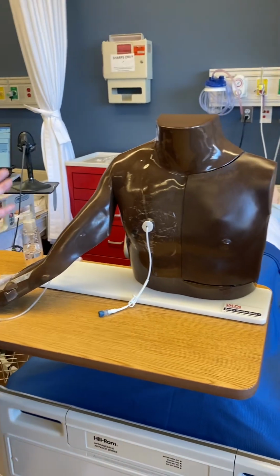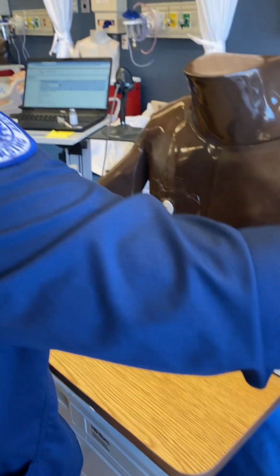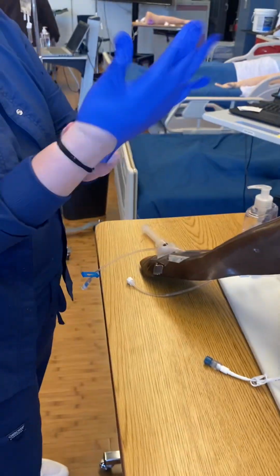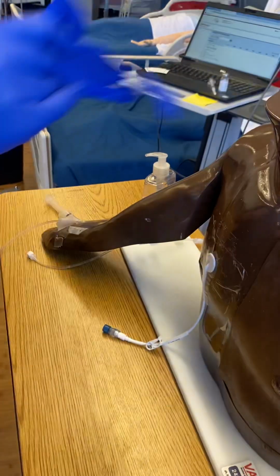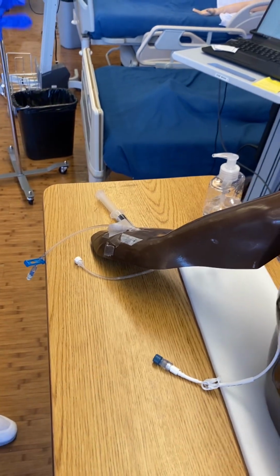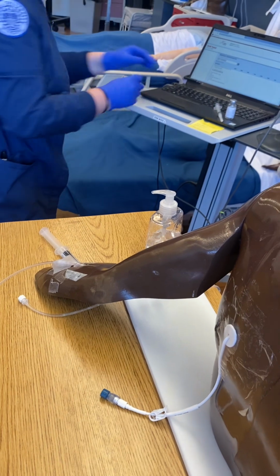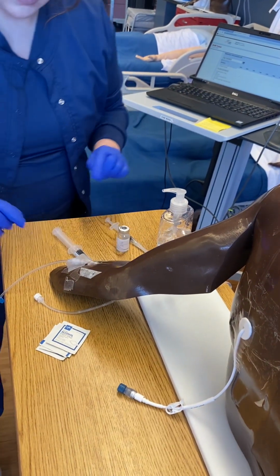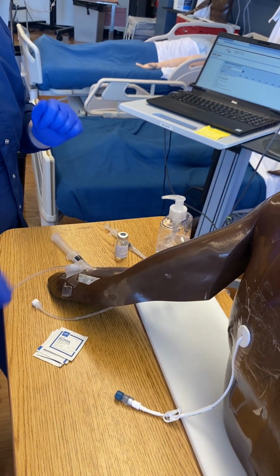So I'm gonna come down here. We're gonna pretend that that's Red's arm right here. So I'm gonna put my gloves on, and before I start, I'm going to assess his IV site and make sure that it's not inflamed or red. All right, so I don't see any redness, phlebitis, inflammation. Everything looks good.